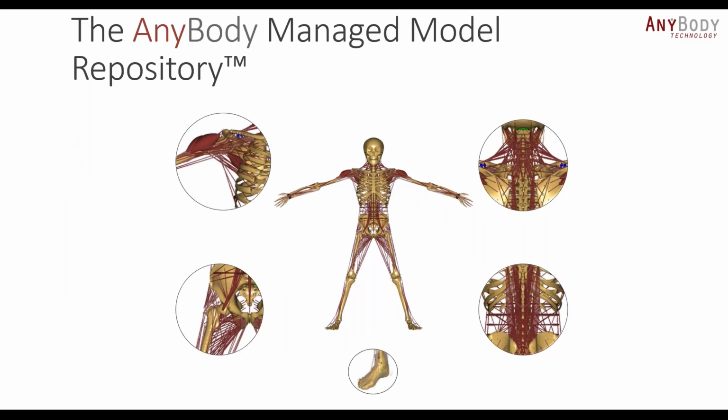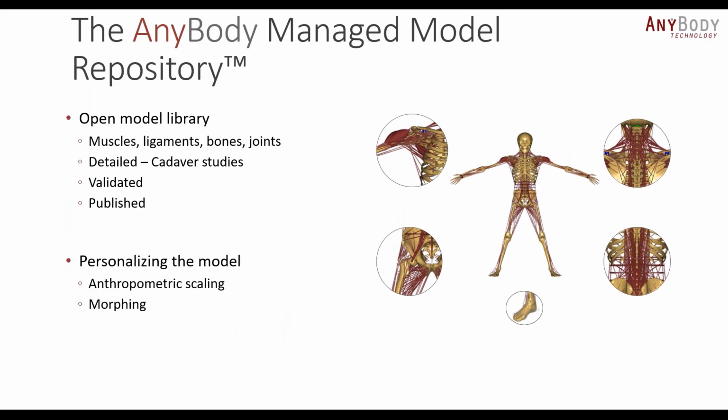The AnyBody Managed Model Repository. So this is an open model library with a detailed representation of the musculoskeletal structure. So there are models of muscles, ligaments, bones, and joints. And this detailed data set has been obtained through several cadaver studies conducted by different research groups.